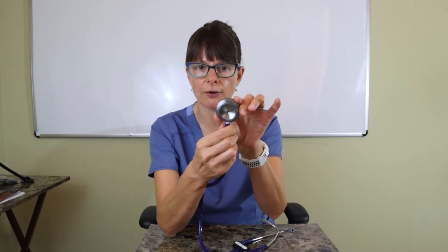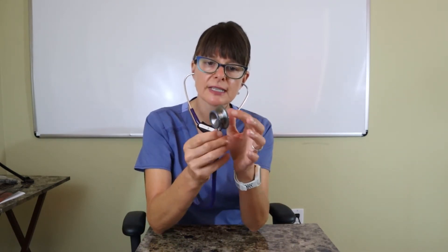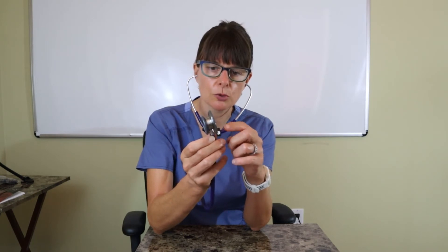Make sure that you flip that part around so you're listening to the correct side. When placing it in your ears, always make sure the earpieces go towards your nose so that it forms a nice seal. Then gently tap each surface to see where you can hear it — be very gentle, because it projects and can be quite uncomfortable if you tap too much.